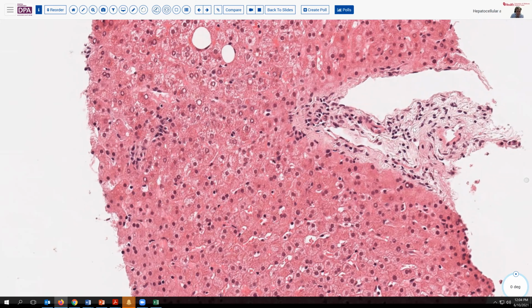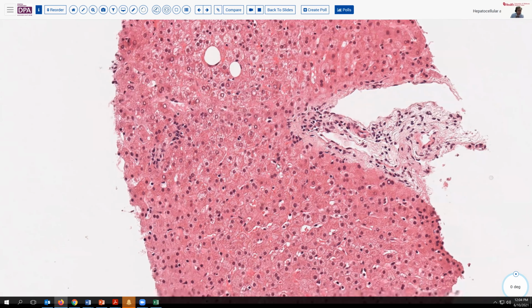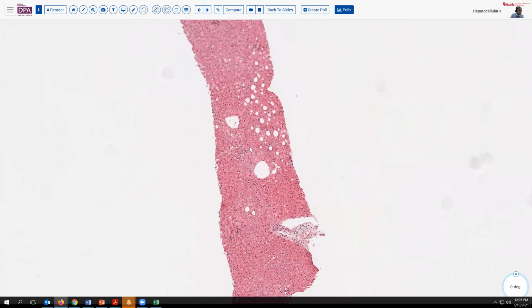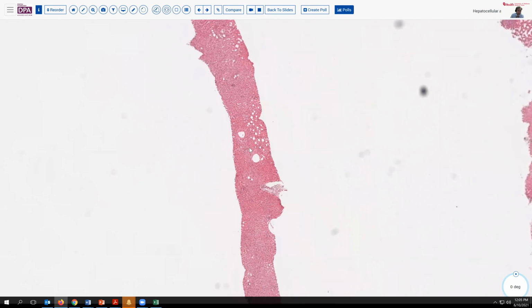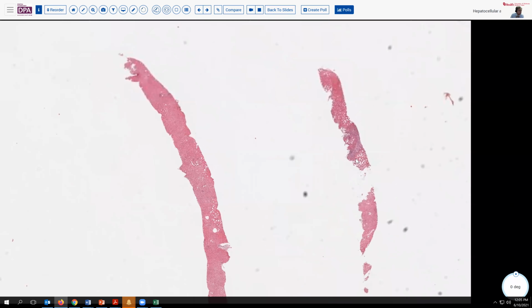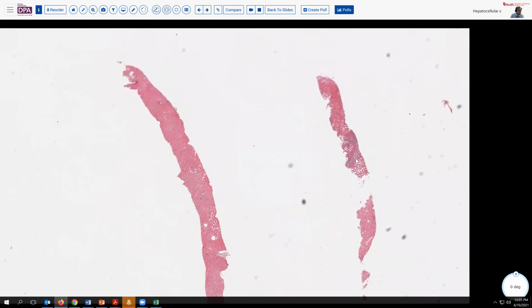I've got a vein, I've got a little arteriole, I'm not seeing a bile duct here. Seeing that kind of criterion would begin to make you think of the possibility that this was an adenoma. Then you'd want to look at a few others to see if that was holding true, or if you were just missing it because of sectioning.